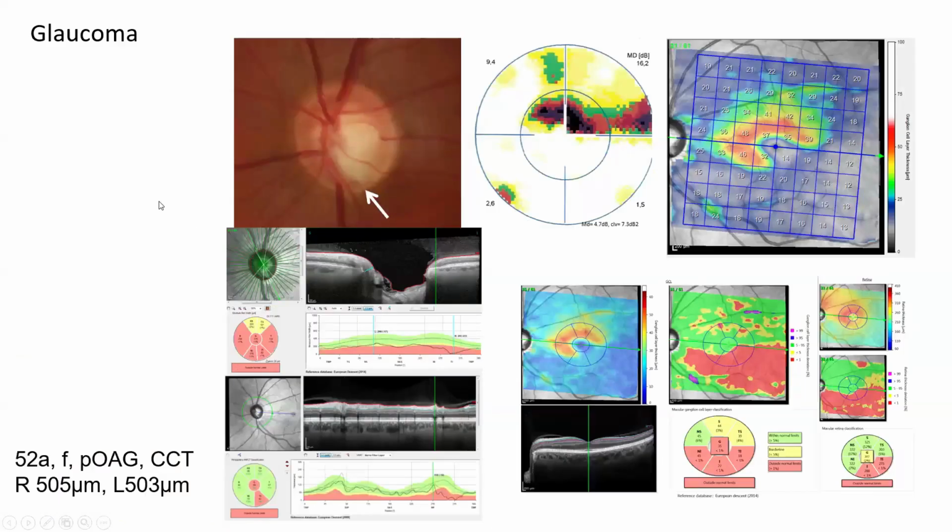But to begin with, we first encounter our glaucoma patient. Glaucomatous optic atrophy is the optic atrophy most often seen in our everyday life, and it's quite easy to diagnose because during the disease we have an enlargement of our optic cup. We have a loss of rim, and the rim keeps the same color as the healthy rim, in contrast to simple optic atrophy. The loss of rim is flanked with a loss of retinal nerve fiber layer thickness.